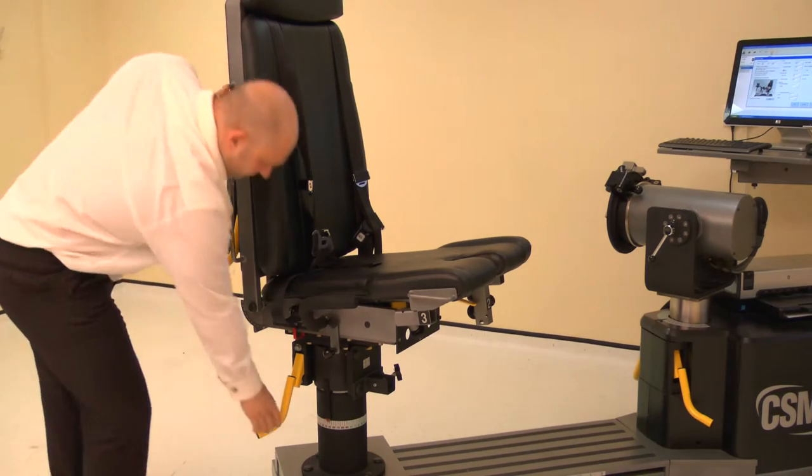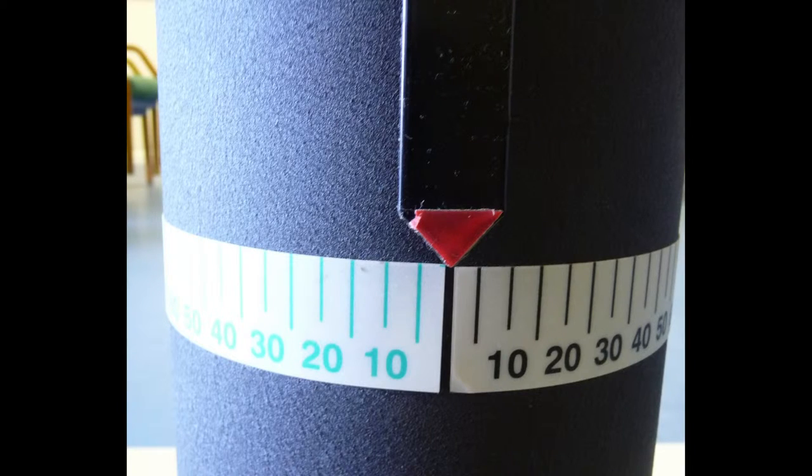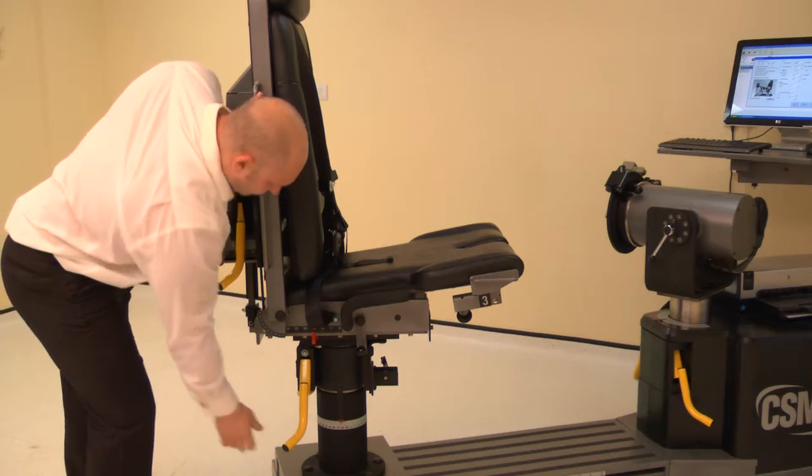Now adjust the chair rotation. Lift the locking handle and rotate the chair. Rotate the chair to 0 degrees on the black scale. Ensure both locking handles are pushed down to secure.